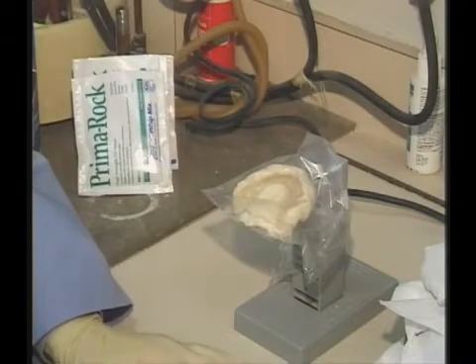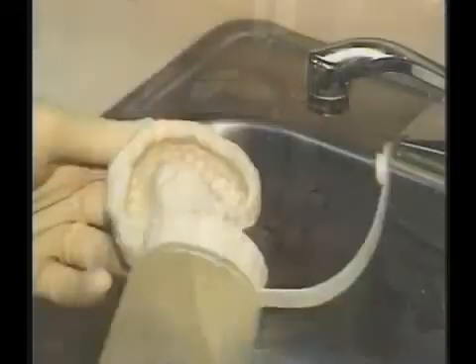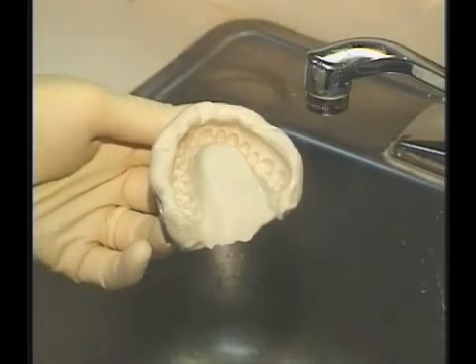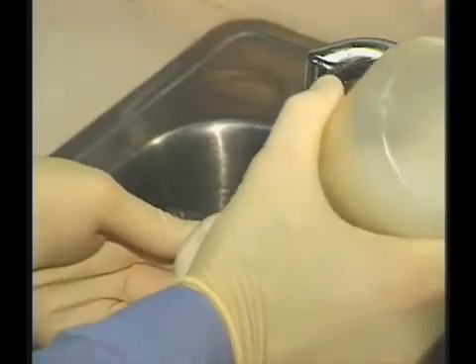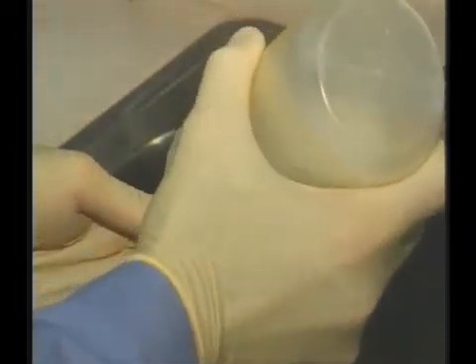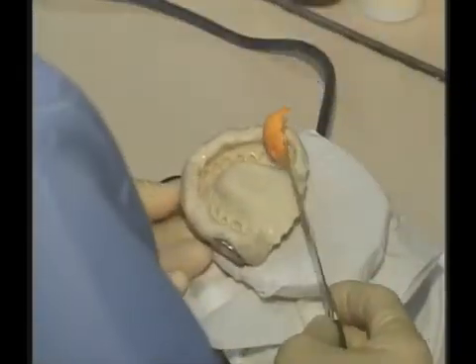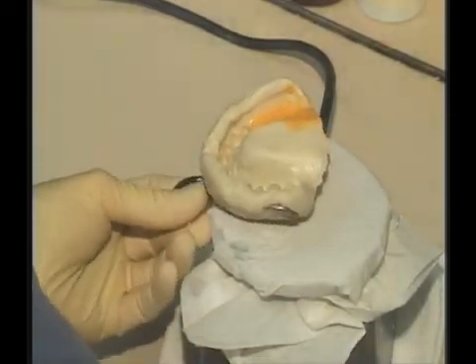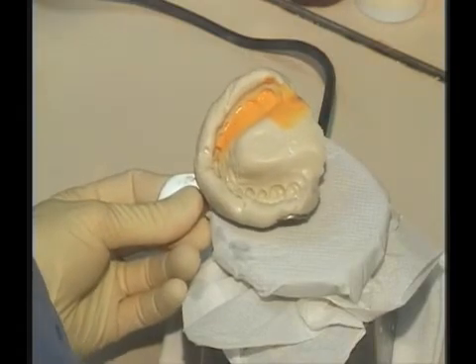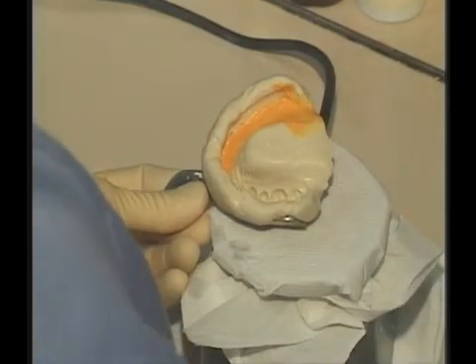It's critical to know that once the alginate impression is removed from the mouth, we only have a 10-minute period in which to pour it. What's inside the impression at this point is saliva and also the disinfectant. A very good way to absorb that and assure we're removing all of it is to sprinkle this with stone. Using a vibrator, we want to start on one edge of the impression and watch it pour, always watching the leading edge and adding to the original.